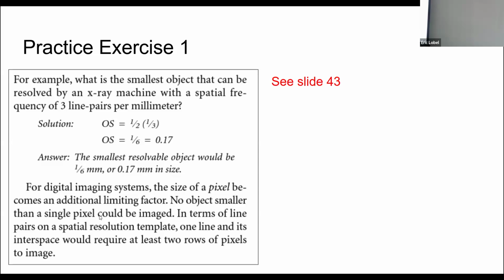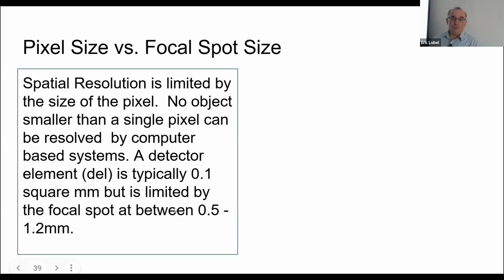So that's an issue. Again, potentially leading to a misdiagnosis. And that's not great because who wants to come back when you actually feel the lump, and then it's maybe big enough to visualize. So I think that's what's being said here, right?